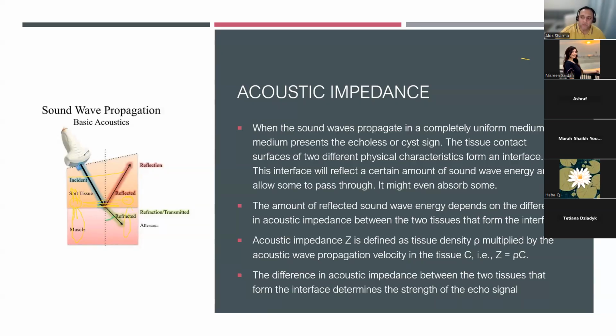So really, your probe has to be placed in such a way that it can get sound waves to move between the ribs to be able to interpret artifact below that. The difference in acoustic impedance between the ribs and the pleura, as well as the intercostal space and the pleura, means that sound waves penetrate better between bone, because bone is a high reflector, and there is a massive difference in the acoustic impedance between the bone tissue interface as opposed to the muscle pleural tissue interface.